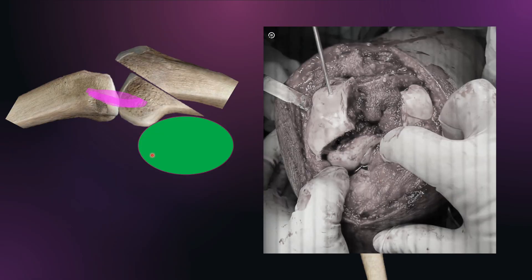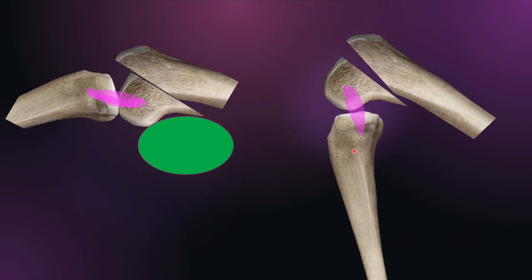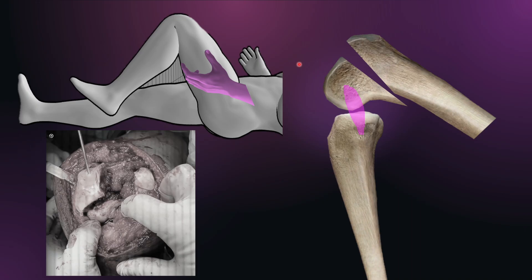So here comes the maneuver. Normally we put a bolster underneath the distal femur or knee joint. The posterior part is blocked from visualization by the anterior fragment and the tibia. If we flex it more, we can see it better, but reduction is still difficult. So you can ask your assistant to simply lift the femur up. By doing that, there will be some gap at the fracture site, giving you space to maneuver the fragment to the level of the joint. This also allows you to flex the knee joint further and visualize the posterior fragments.